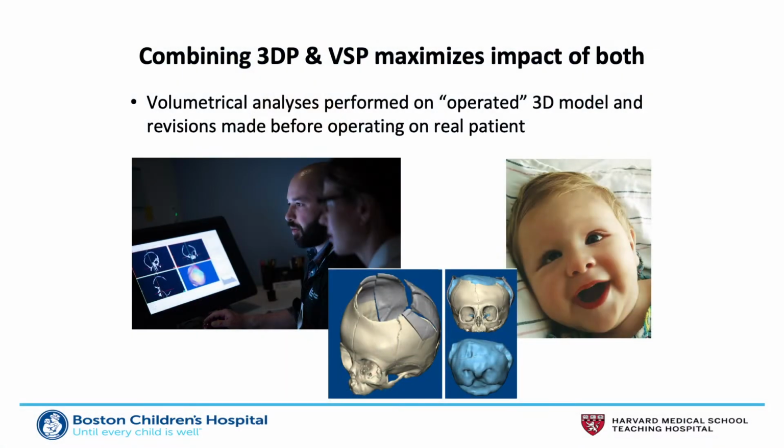Took that opportunity to then make some new osteotomies and barrel staves on our operated skull, rescan, and work through an iterative process to a point where we felt that we had theoretically confirmed both on the model and through the digital analyses that what we were bringing to the patient was going to solve the problem. And that was translated intraoperatively to the patient with a successful result.